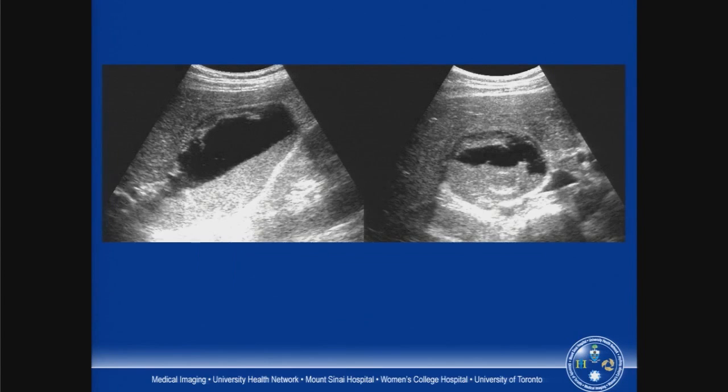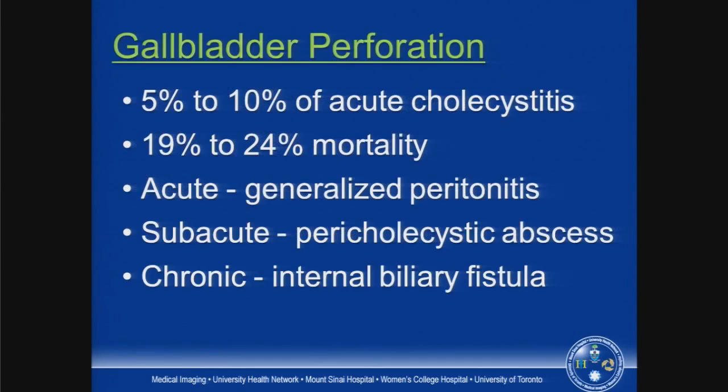So we brought the patient immediately to ultrasound, and we see the sloughed mucosa giving you intraluminal membranes. You see this asymmetric wall thickening, which allows you to make that diagnosis of gangrenous cholecystitis. It's also a distended gallbladder with a fluid debris level within it.